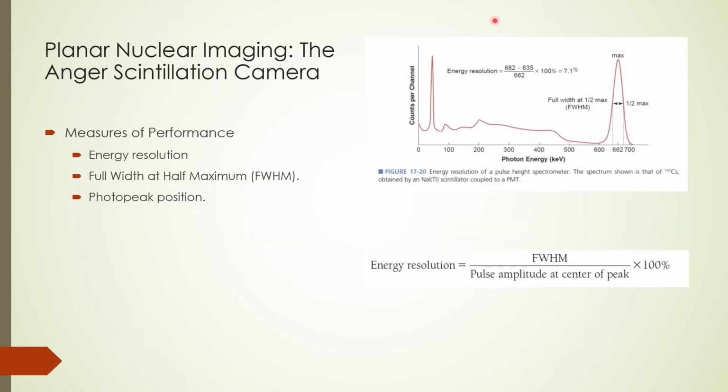Energy resolution is the ability of the detector to differentiate between photons of different energies. It is determined by measuring the width of the resulting pulse height spectrum and using the formula shown.